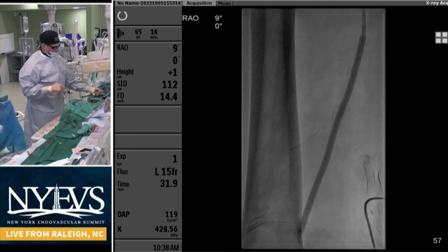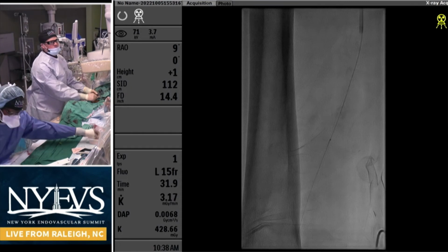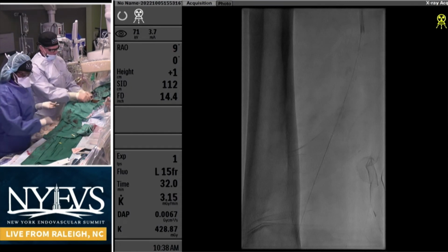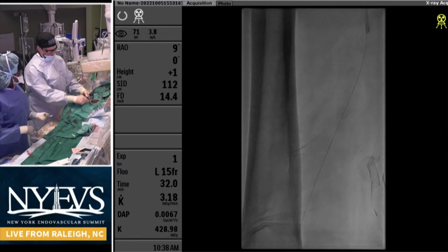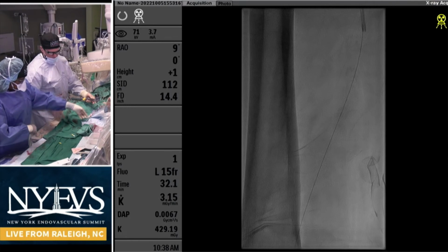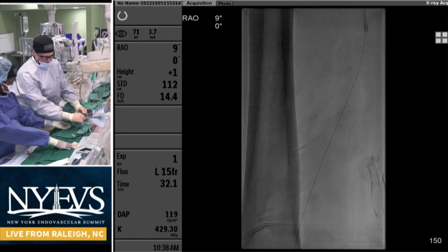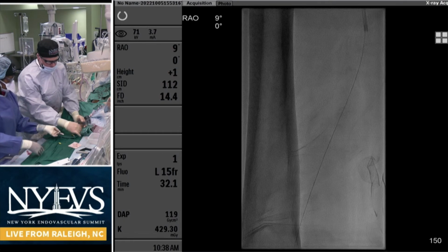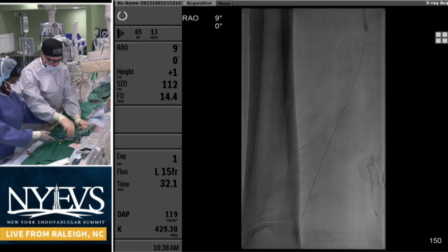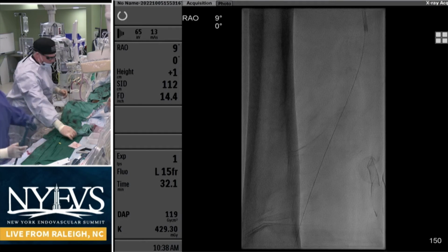So just to get the panel in, from your perspective, for balloon sizing, is there a rough math rule you do? Add the two balloons, divide by 2, do a 2/3, or is it just random picking the numbers based on the vessel sizing? So I'm a big proponent of using a lot of ultrasound during my cases, and I do the measurements using ultrasound, and it gives me a really good match of what we should use. I would actually go lesser because the concept over here is just to see that they both match. That would be my technique. Any other different perspective?